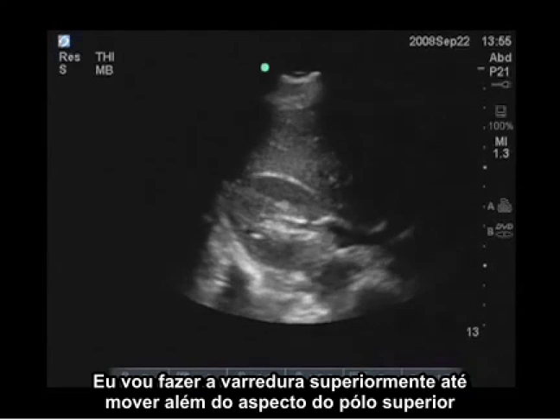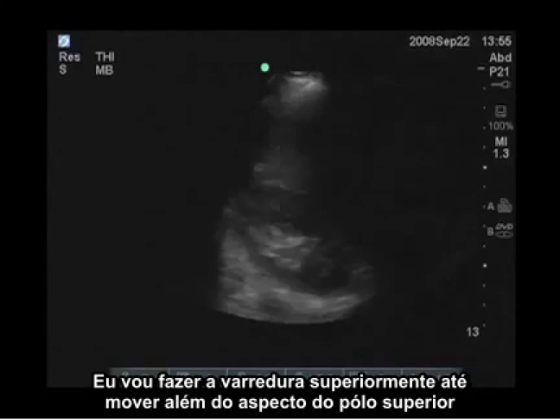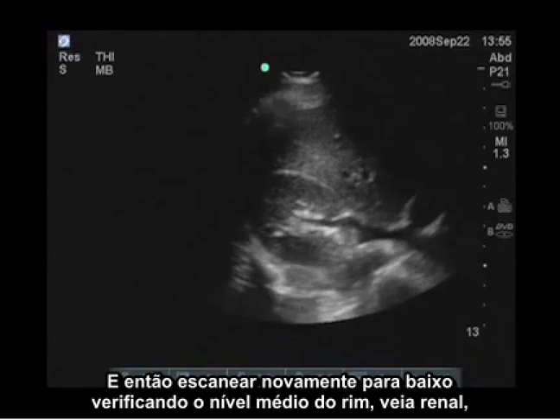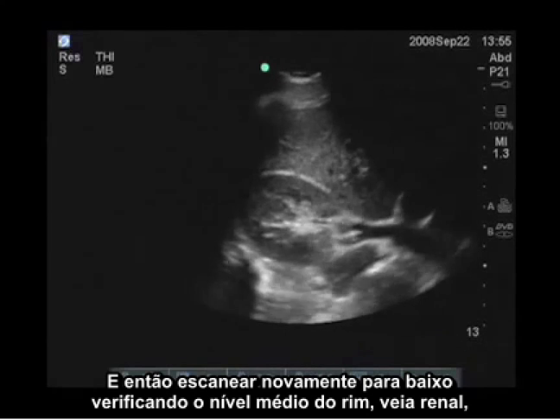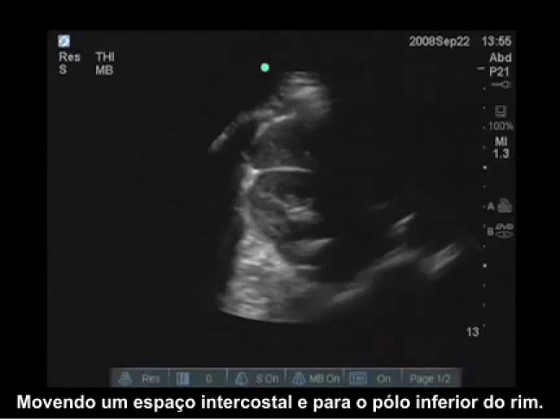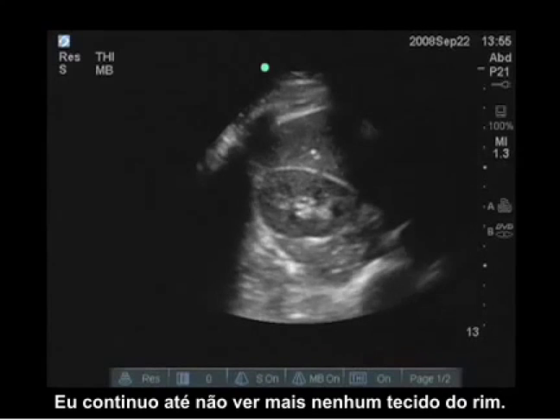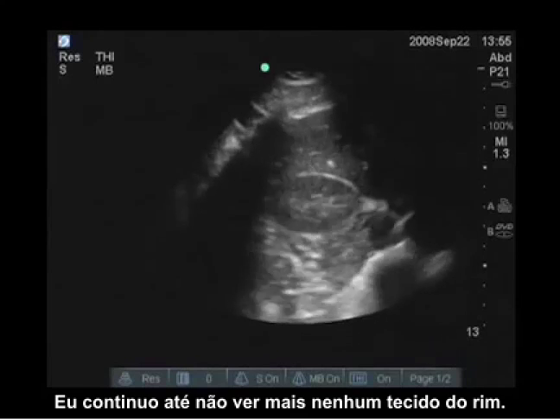I'm going to sweep superiorly until I move past the superior aspect of the upper pole, and then sweep back down inferiorly, seeing the mid-level of the kidney, the renal vein, moving down a rib space and into the inferior pole of the kidney. I continue until I do not see any tissue of the kidney anymore.